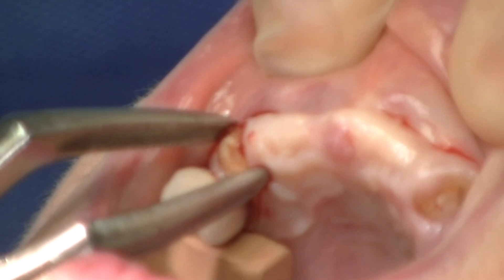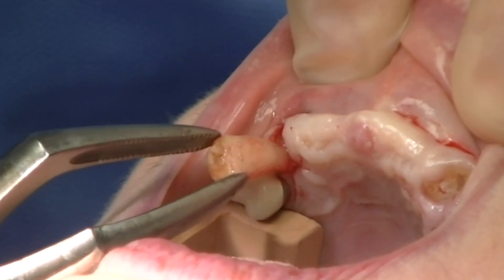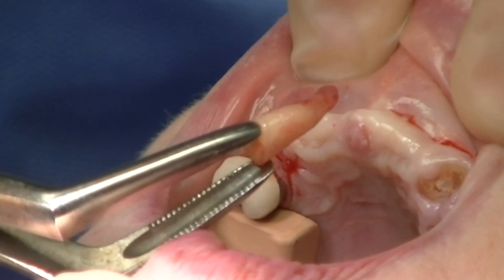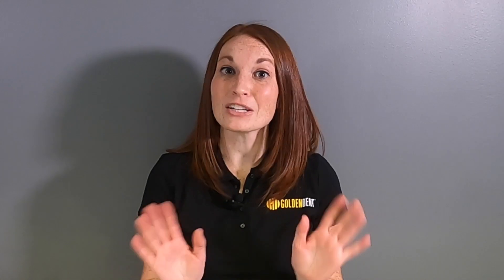To remove the tooth in total, I will take what we call a tooth delivery instrument, a bird beak forcep, and I will simply rotate the tooth out of the socket in what I refer to as an atraumatic or minimally traumatic extraction technique.